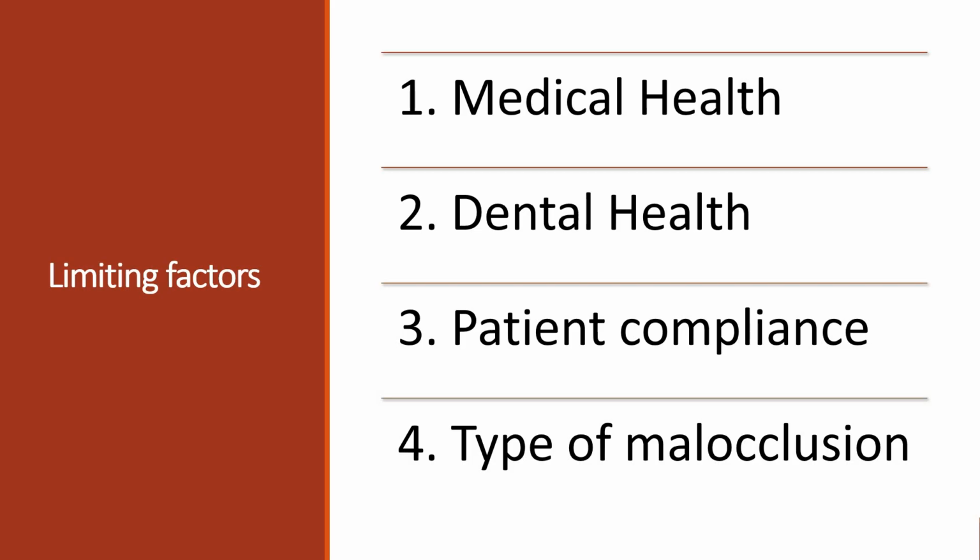A number of potential limiting factors will relate directly to the patient. Medical health, dental health, excellent oral hygiene, and an absence of active dental disease are prerequisites prior to orthodontic treatment. Fixed appliances, in particular, can exacerbate dental problems.